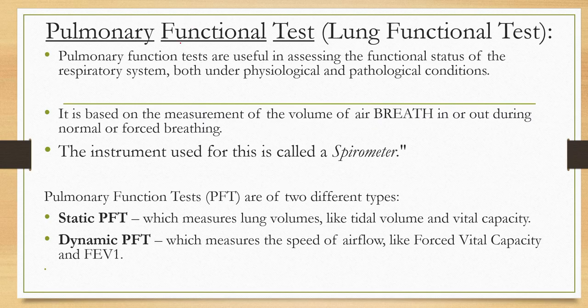Pulmonary function test is also called PFTs, meaning lung function test. It is used to measure how your lungs are working, how we breathe in, we breathe out. It is very useful in disease conditions like asthma patients. It is of two types, static and dynamic.